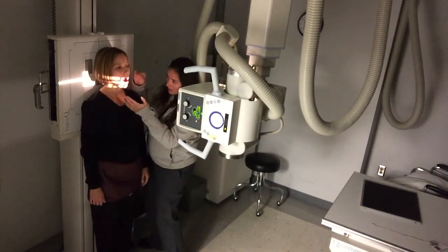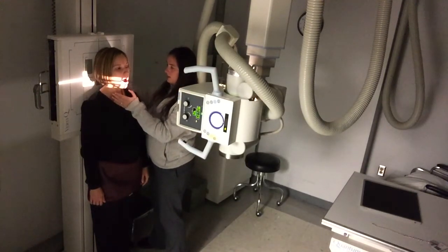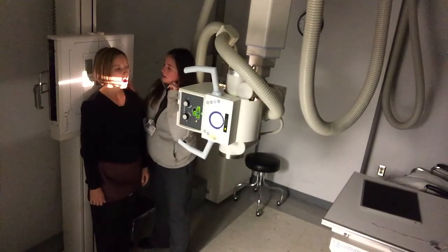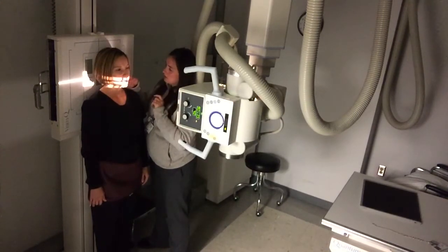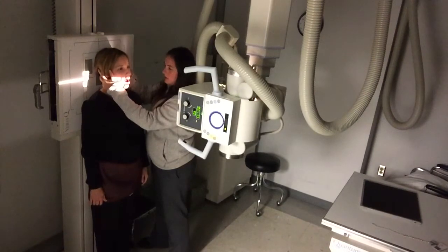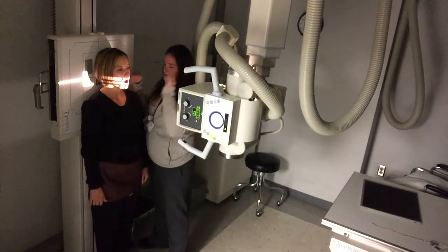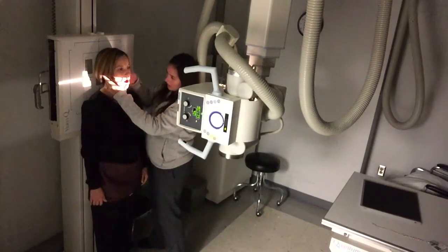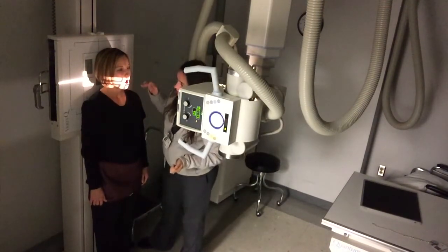You're going to look at the lower line of their molars and all of their teeth and their incisors. And then I'm going to come back here and find the mastoid process. It's right behind the ear, and it just kind of is a bony projection there. So look for that, and then I'm going to look for her incisor, and then I'm going to kind of raise or lower her head to make sure that those things end up parallel with the floor and in a horizontal orientation together. So I'm going to lower her down just a little bit right there, and that actually looks pretty good with my centering because I'm right through her mouth there.